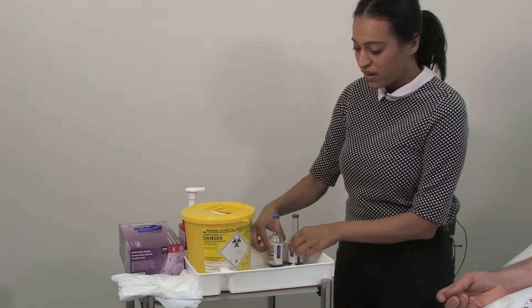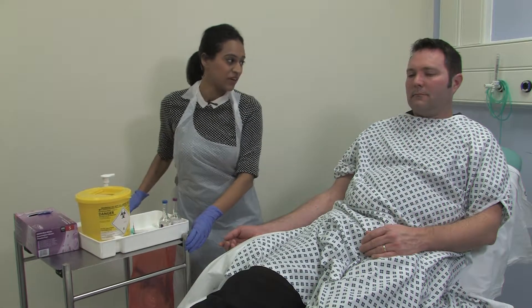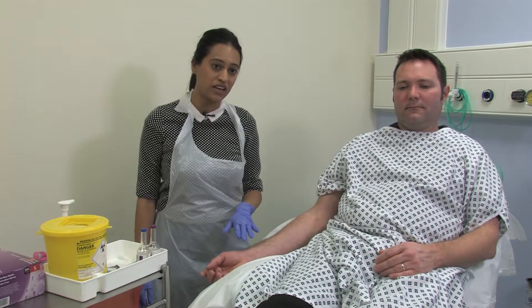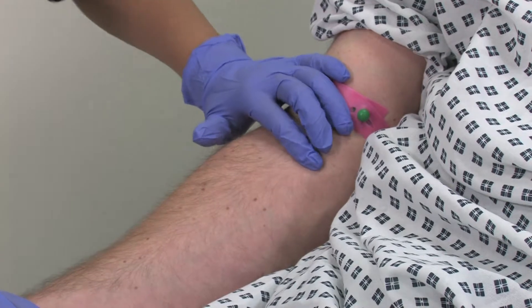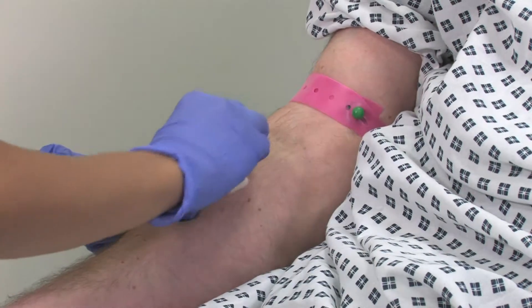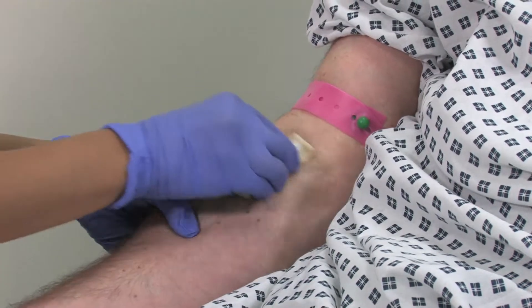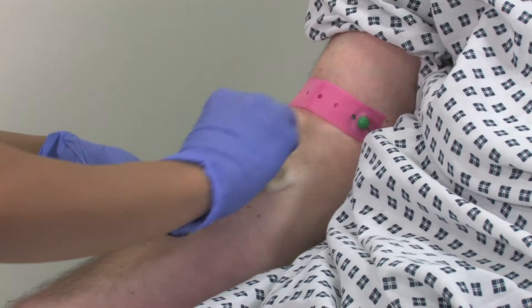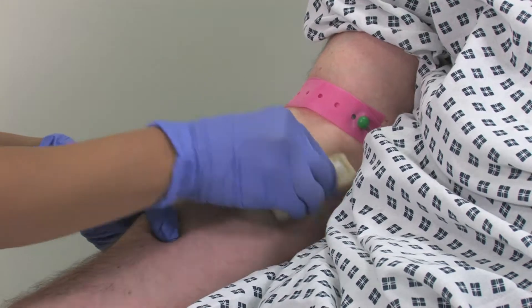Whilst these are left to dry, we can now decontaminate our hands again and put on gloves and apron. Ralph will be acting as our patient. He has already kindly agreed and consented to have his blood cultures taken today. We can apply our tourniquet and try to identify a vein. Once a suitable vein has been identified, we can clean this area using the chlorhexidine applicator, using up and down and back and forth strokes for 30 seconds.